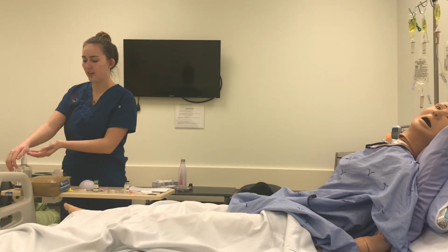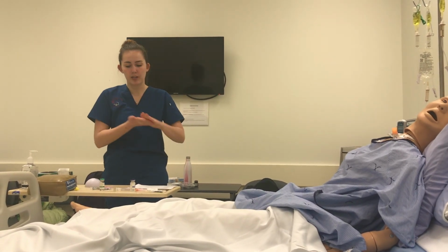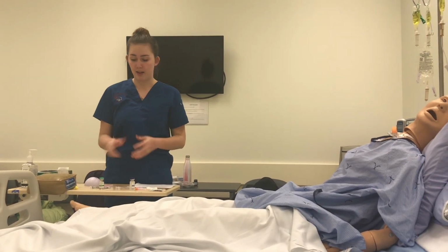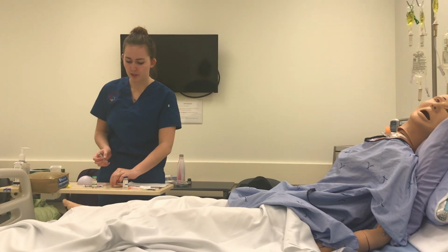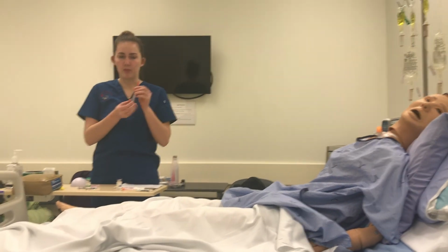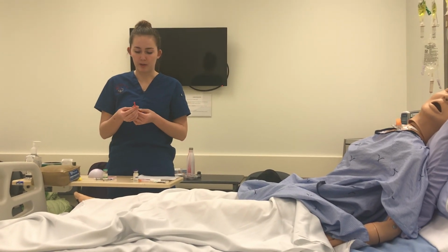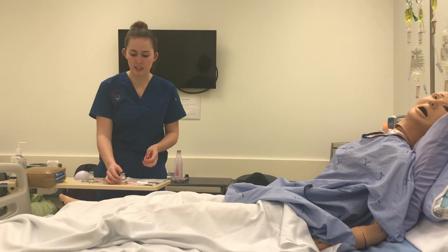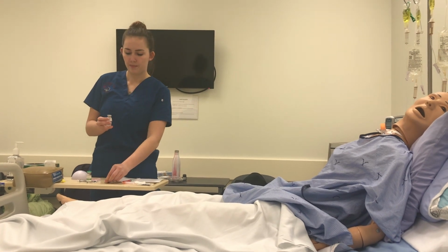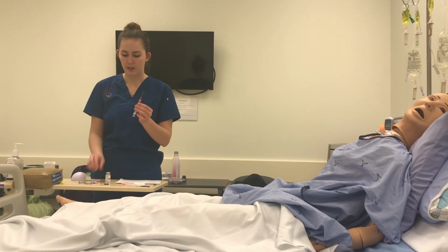Okay, so now we're going to perform hand hygiene before we assemble our subcutaneous and IM needles. For our subcutaneous needle, we're going to use a 25 gauge needle, and this is my heparin, and I have Haldol here. So now I'm just going to use a blunt needle to administer the medication. I'm using a 3 milliliter syringe for the heparin, because we are administering 1 milliliter to Mr. Mancini. Now I'm going to open the cap away from me, take off the cap of the blunt needle.